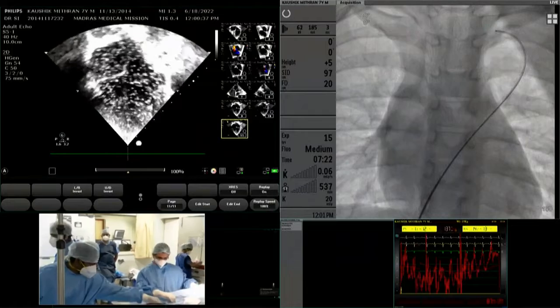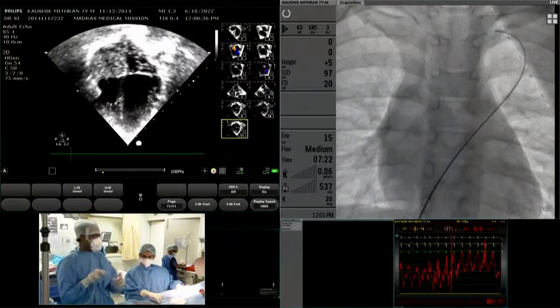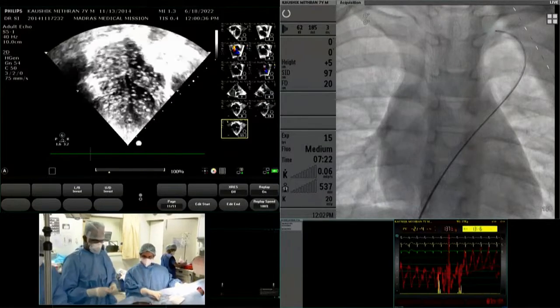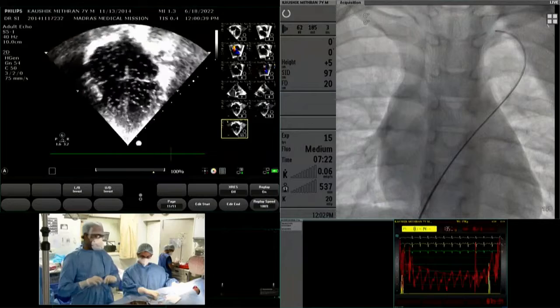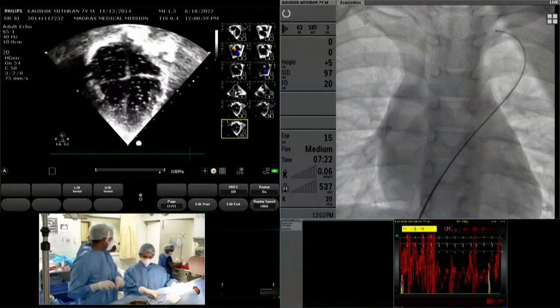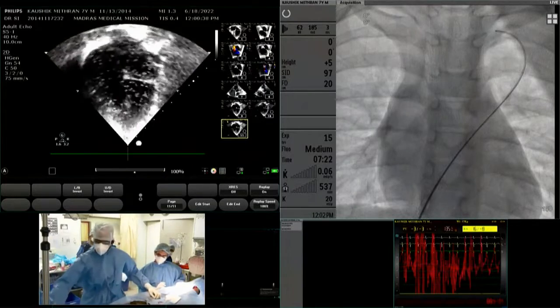The smaller the better, because we will not be occupying too much space in the RA and LA. Check whether we have a 12 into 3 Tyshak. So to understand, this is a case of an isolated hypoplastic right heart syndrome, the borderline RV, if I am correct. With a borderline RV and exclusively right to left shunting ASD with no left right shunt.